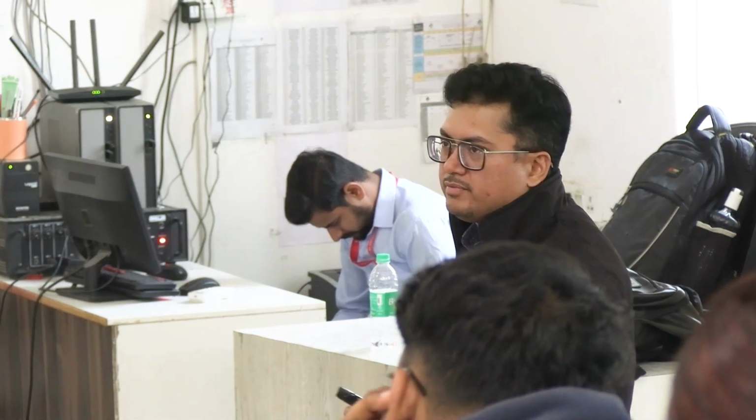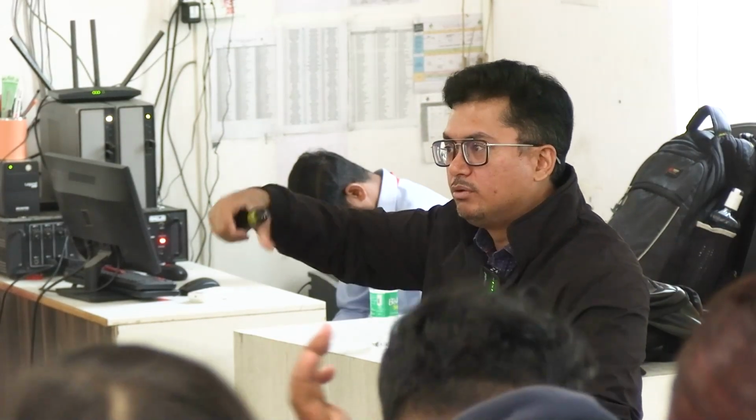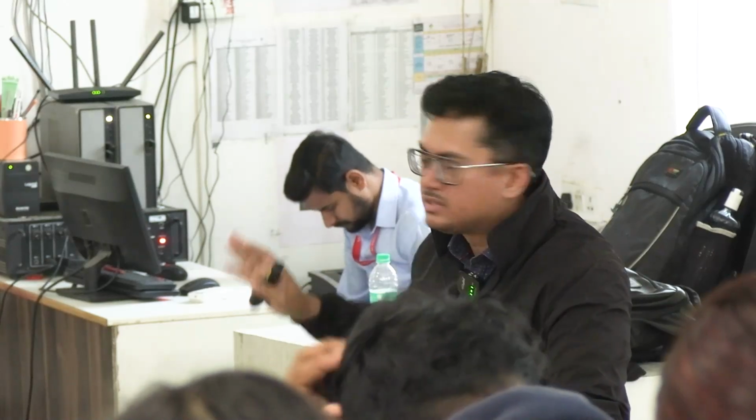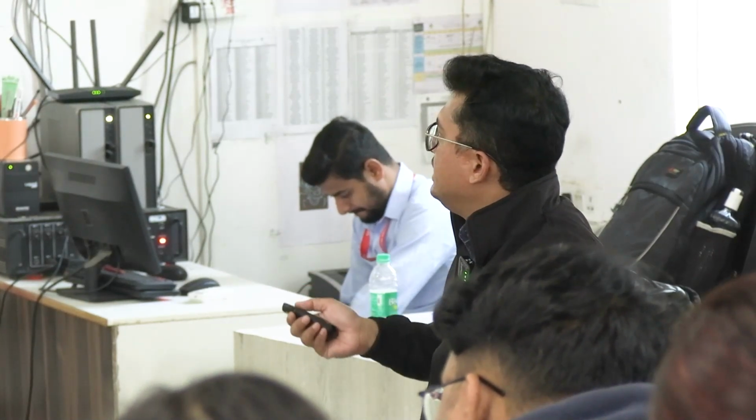আচ্ছা, নেক্সট হচ্ছে ফিল্ম অ্যারে। Film array is a kind of advanced PCR, যেখানে কিনা ওই যে প্রাইমারগুলো আমি দিচ্ছি সেগুলো সর্ট অফ মেমব্রেনের উপরে অলরেডি বসানো আছে। You don't have to understand the details right now, but remember the name film array. Now there is a real time PCR.